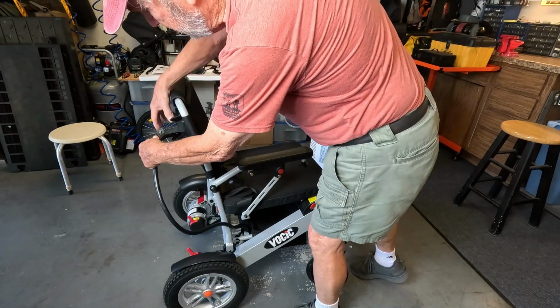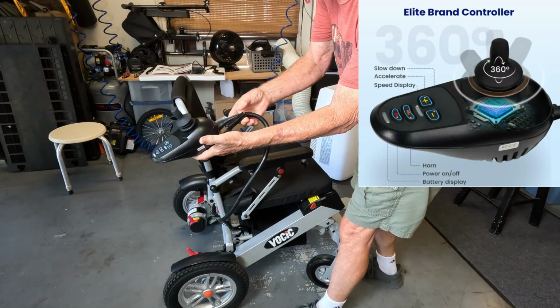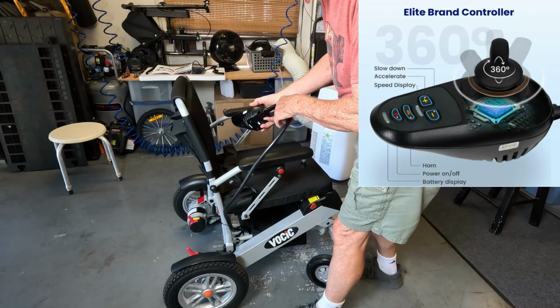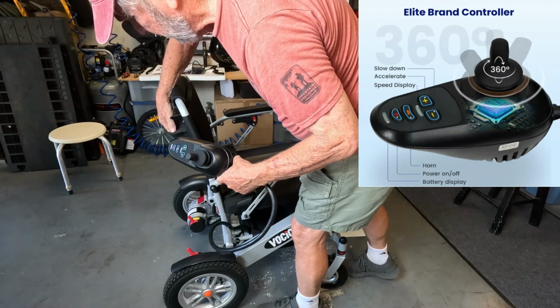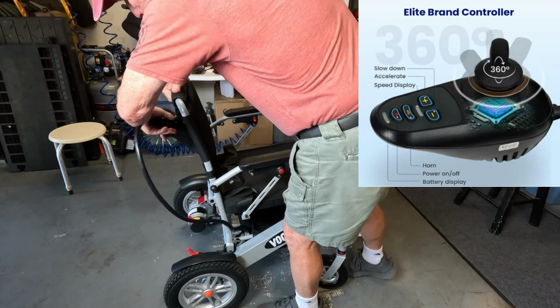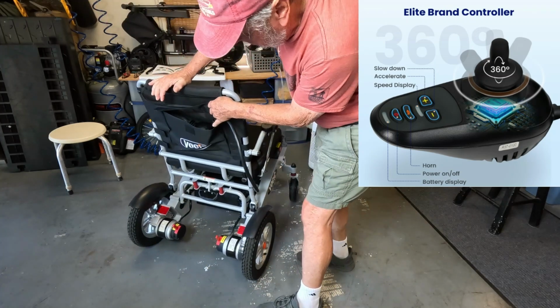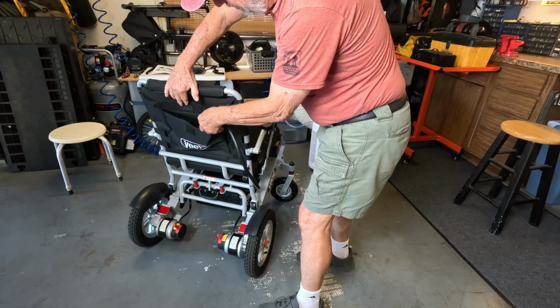Now I have this controller stored in there. When it comes in the package, this is going to be loose with bubble wrap around it, and so when you take it out, secure this. This may be a good place to put it, in this little storage pouch on the back, so that it's not dropping and falling on the floor.